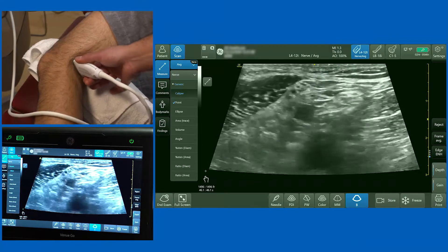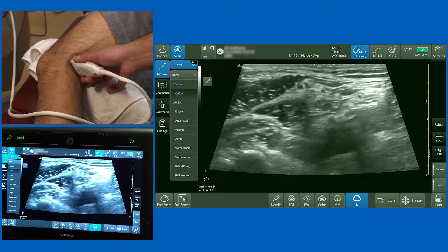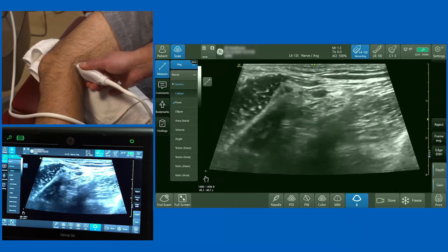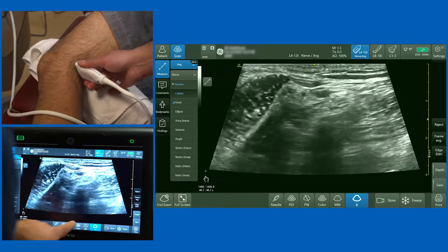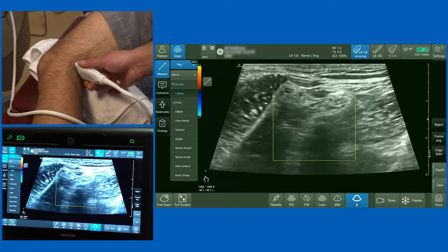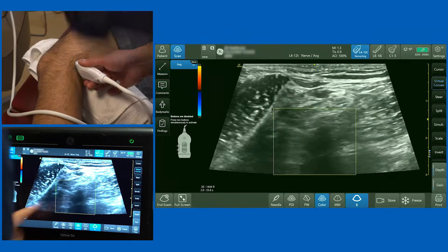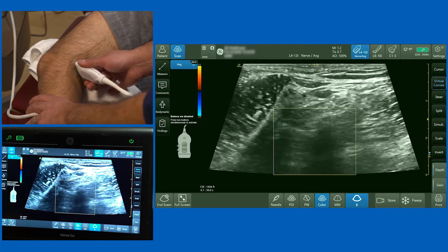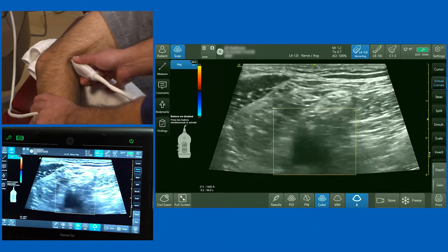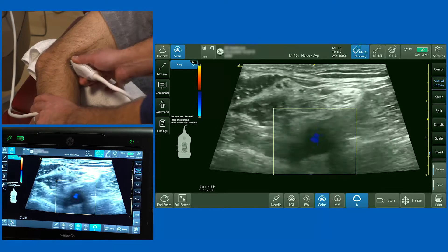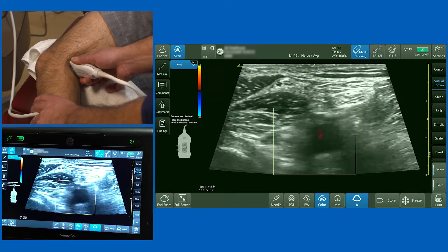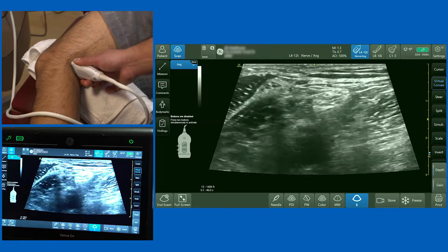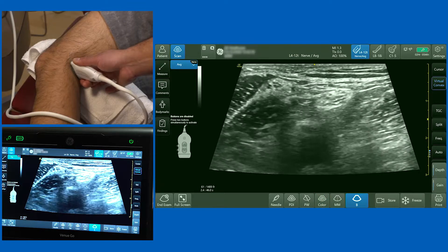By increasing and reducing the pressure, you'll see at the bottom of the screen a pulsatile structure which is the popliteal artery, and just above that coming into screen is the popliteal vein. If I put the color Doppler on, I can highlight the vein by squeezing the calf — you'll see the vein blush. Increasing the pressure shows the artery right underneath.